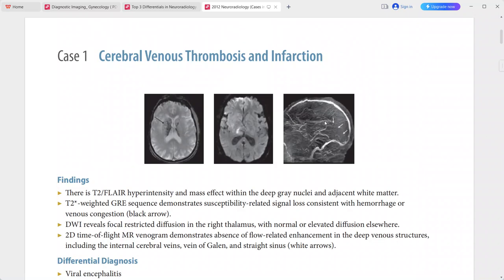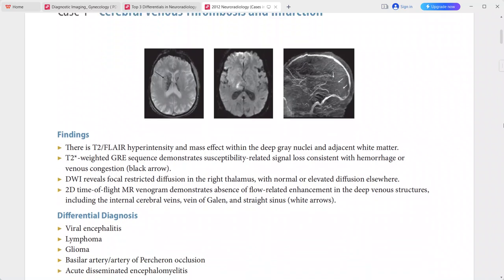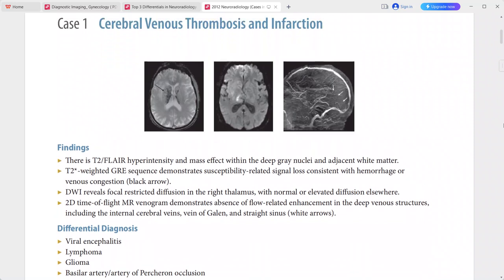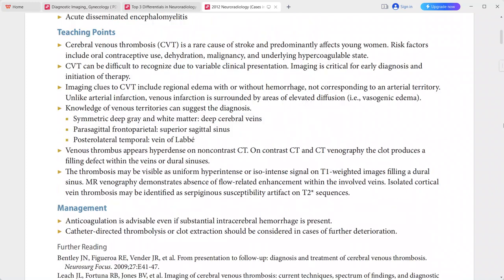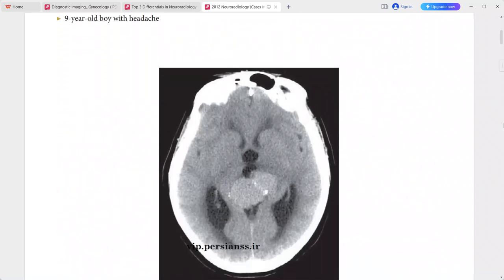The 2D time-of-flight MR venogram shows absence of flow-related enhancement in the deep venous structures, including the internal cerebral veins, the vein of Galen, and the straight sinus. Differentials include viral encephalitis, lymphoma, glioma, basilar artery occlusion, and ADEM. However, the diagnosis is cerebral venous thrombosis and infarction.